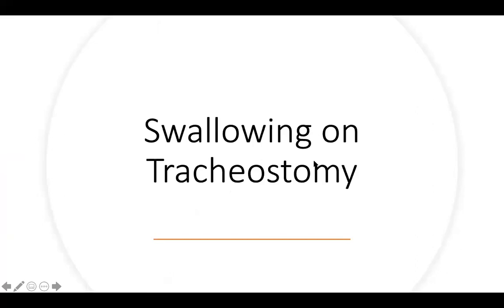How can some tracheostomy patients speak without a speaking valve? Good question. As we said, sometimes if the patient's trach is small enough in comparison to their airway, then they would have more air to leak around the trach, even if they don't have that speaking valve on. Some air can escape to the upper airway, and you would notice that the leaked speech that happens without a speaking valve comes and goes.